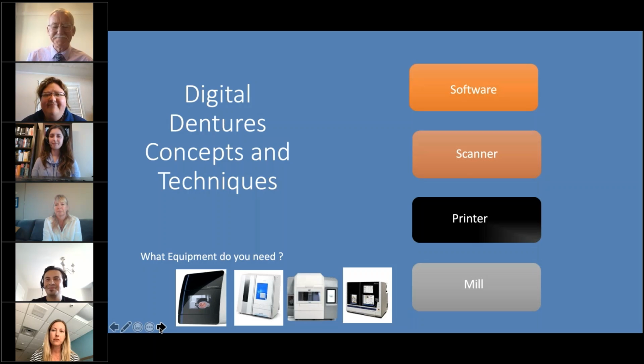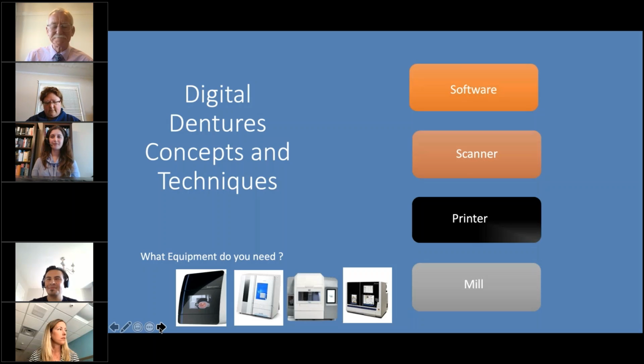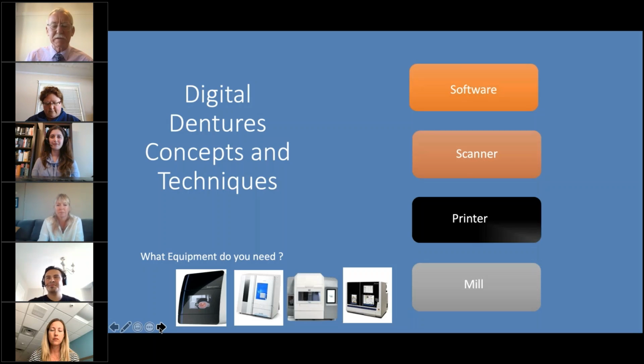But I know that Erica and I were always looking into a lot of the different mills. For what we want it for and what we need it for, specifically dentures, we both decided that the PM7 would be the way to go. We both really like Ivoclar and all their products, so it made sense to go that way. The two mills really worth considering are the PM7 from Ivoclar and the IMES iCore.